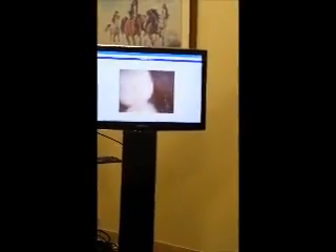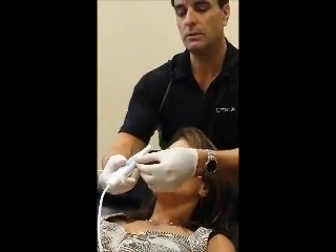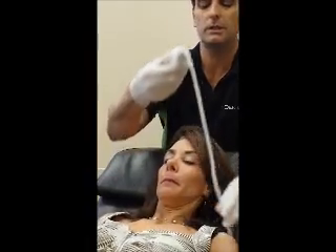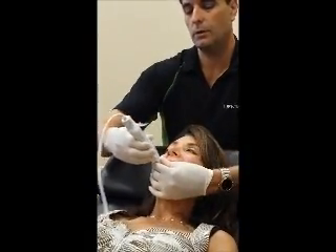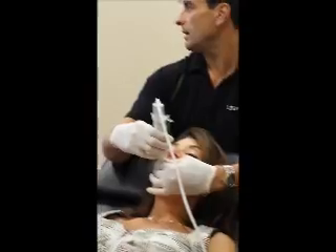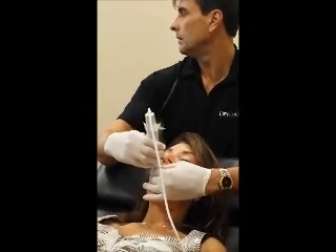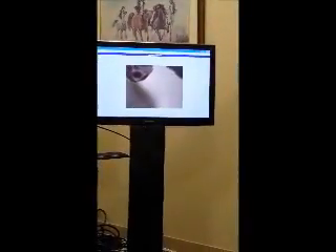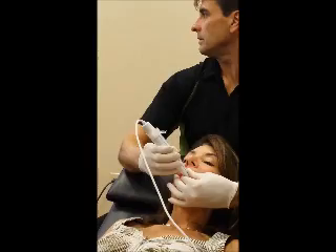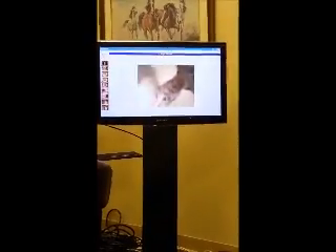For one tooth and anything closer — these last two settings are macro or very magnified — you're always going to be fulcruming on the same arch. Looking at the upper arch, I simply adjust my hand and I find it easiest to hold like this. Notice I'm now fulcruming on the lateral of the upper arch, which keeps my one-tooth distance. I can always adjust until it's in ideal focus with just a little tilt. If I were too close, I'd just fulcrum out and I'm back at the correct distance.